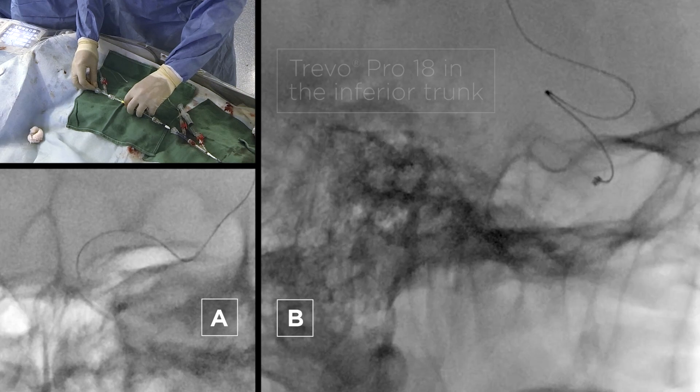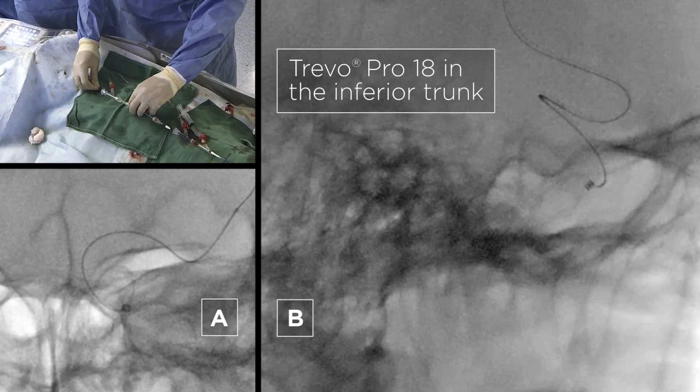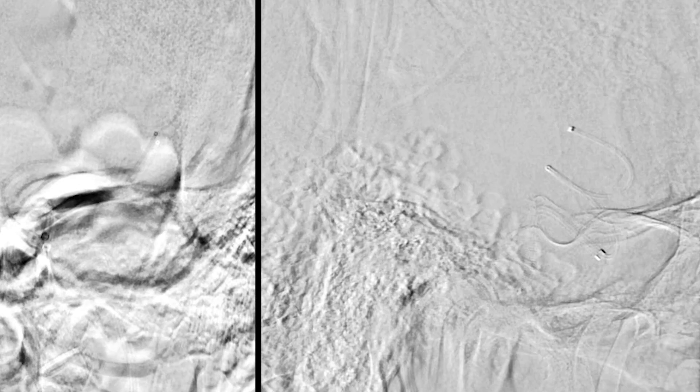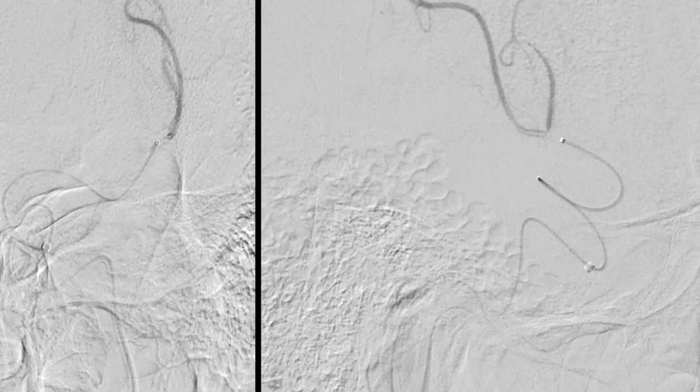The aspiration catheter is navigated towards the infra-ophthalmic segment. There are two methods to navigate to the inferior trunk of the MCA: you can use the micro wire and push the micro catheter over it, or you can push the micro catheter under aspiration without the micro wire.